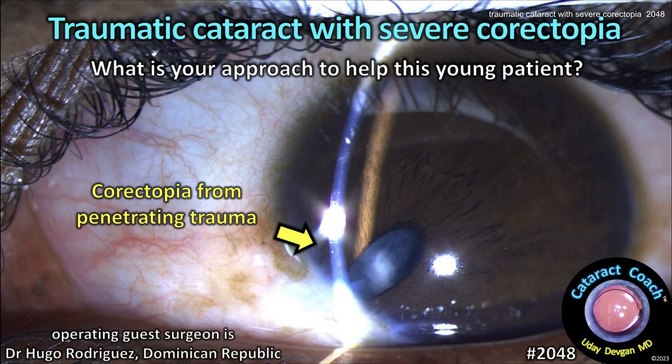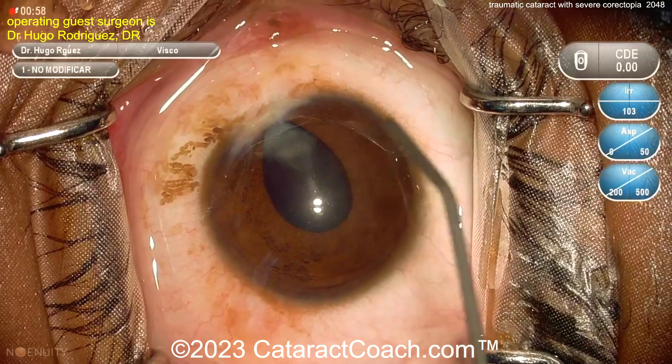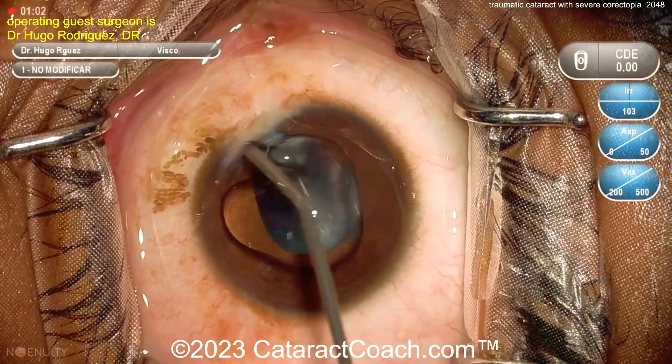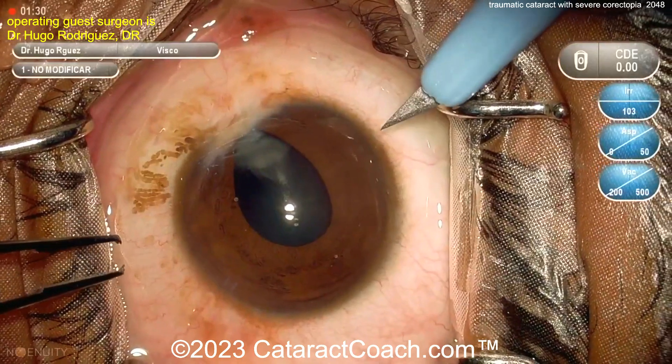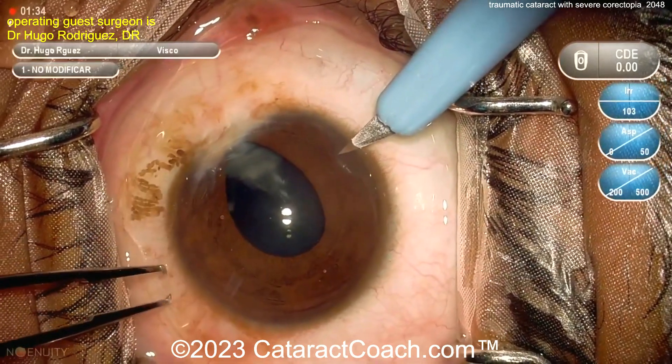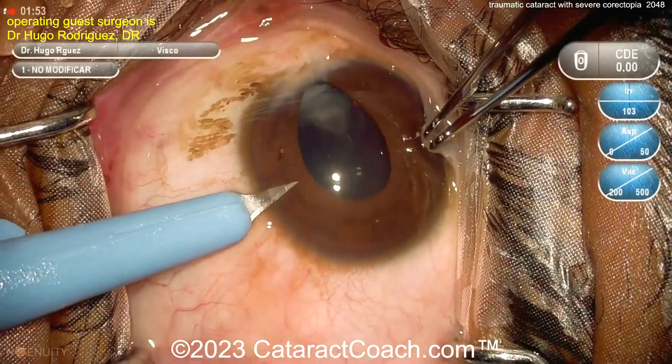From cataractcoach.com: a traumatic cataract with severe corectopia — what's your approach to help this young patient? Look at that damage. There's a small pupil, and it looks like there was a ruptured globe. At the site of the rupture, the iris appears to be trapped within the corneal material. There's a traumatic cataract as well.